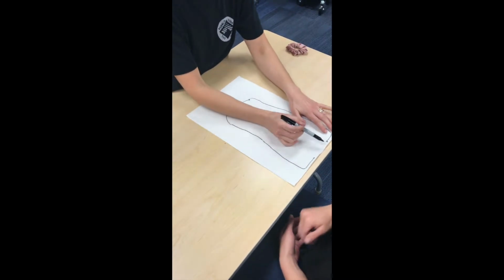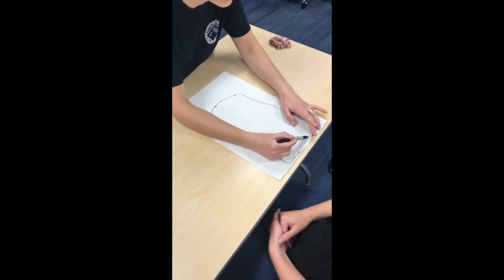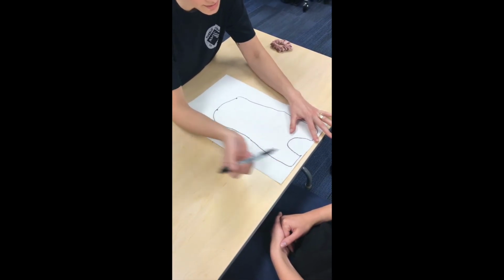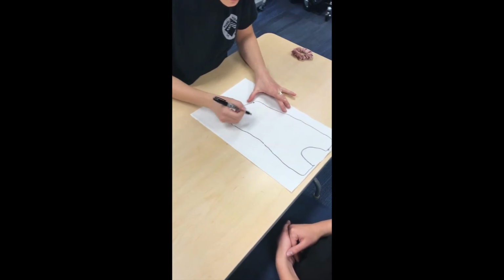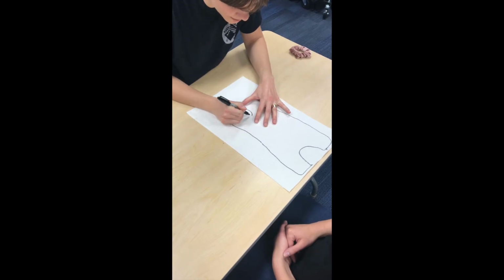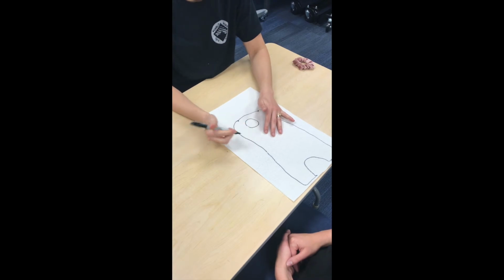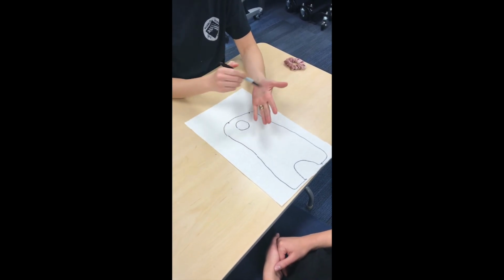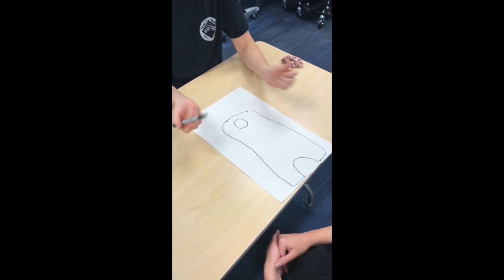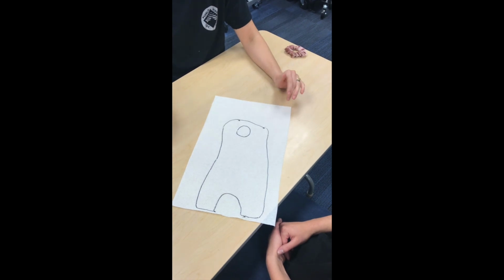Okay, and then between these two marks that I made near Kylie's elbow, I'm just going to go ahead and make a half moon shape. And this is going to allow Kylie to bend her elbow. And then up here, just make a thumb hole. You want to make it big enough that you can roll it out when the plastic is heated, and so that her thenar eminence is completely able to oppose all digits as well as make a fist. And then that is the Muenster Orthosis pattern.